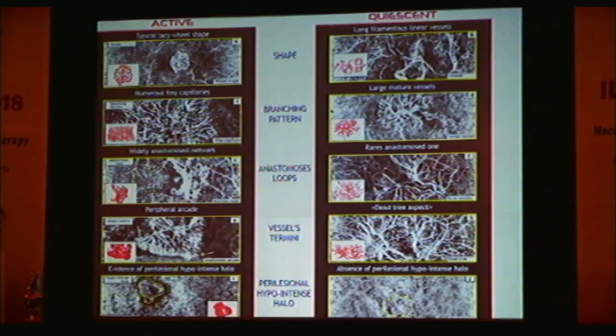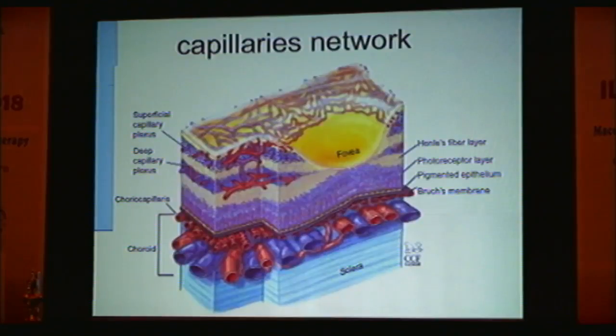But the most important is, when you are dealing with this kind of disease and you are cutting your sections in the deep retina or the outer retina, if you have edema in the neurosensory retina, that shows the activity. So that is the most important sign that what you're dealing with is active. These are the 4 levels we see.